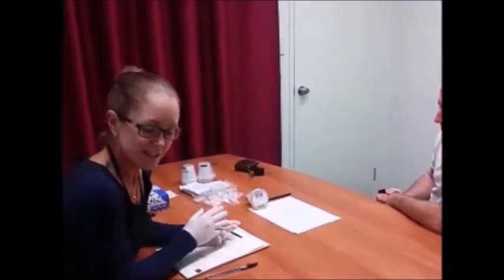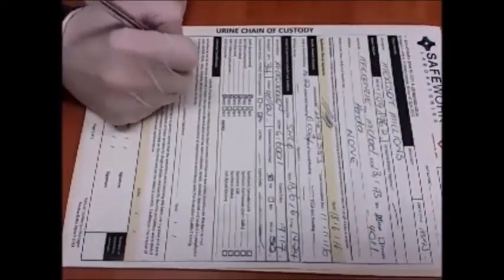Have you got any questions about the test? No, none. Okay. So we're at our 5 minutes and the lines are clearly visible. You don't have any questions, Michael? None, thank you. Okay, so I'm going to document the result as negative, ensuring that you double check your accuracy on documenting the results, and then I'm going to complete the rest of the chain of custody.